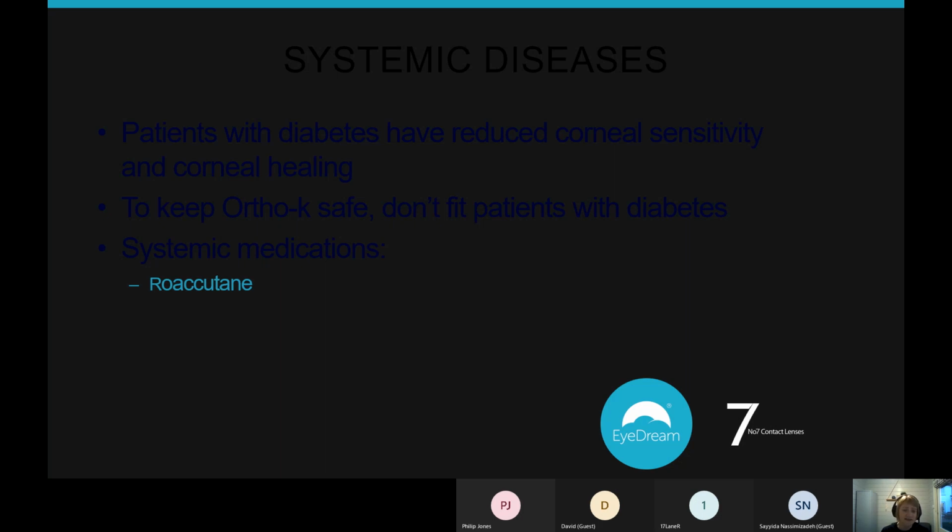And one of them is a patient in their late teens coming in with two bright red, angry eyes, really upset looking. And in my head, I'm going through, have they got an infection? Have they got inflammation and allergy? Are they allergic to the solutions? Have they put peroxide in their eye instead of their regular solution? And I went through all of those regular red eye kind of things before we eventually said, have you started any new medication?